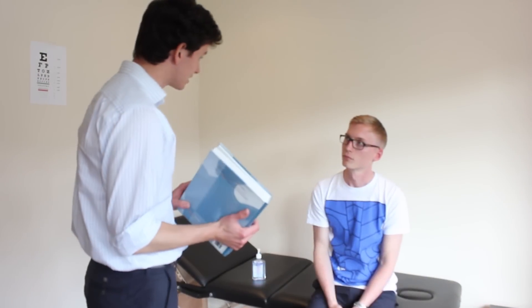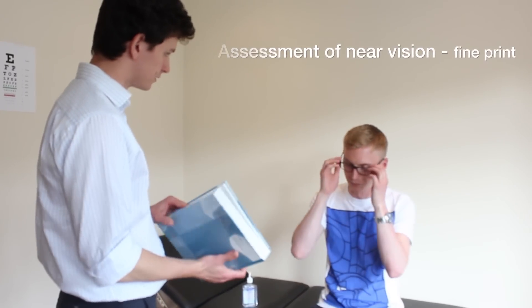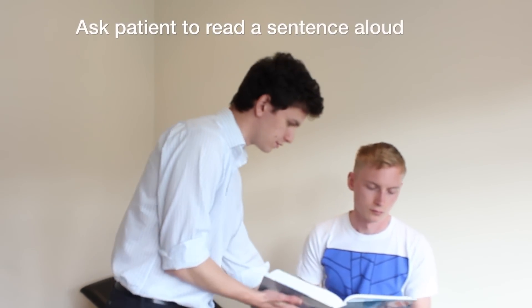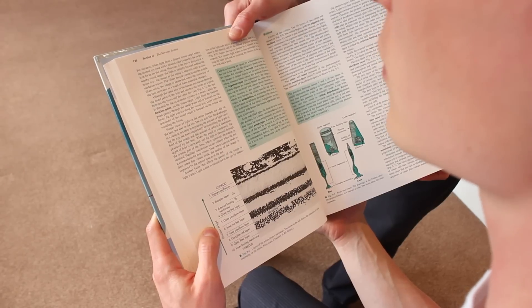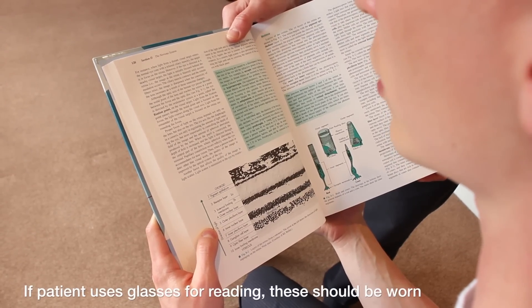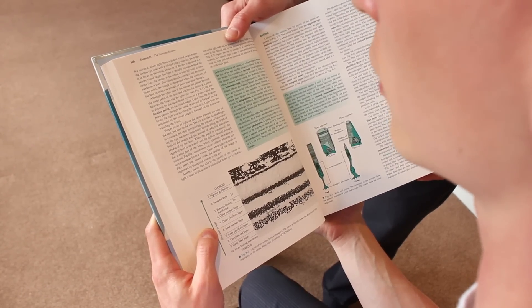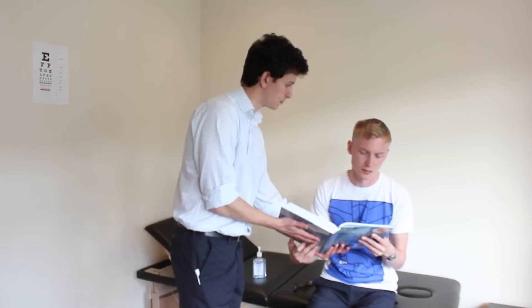So now I'm just going to test your near vision. So if you can take your glasses off for me for this part of the examination, and just read the first sentence of this book for me. When light from a distant visual target enters the normal eye, one with a relaxed ciliary muscle, the target is in focus on the retina. Thank you very much.